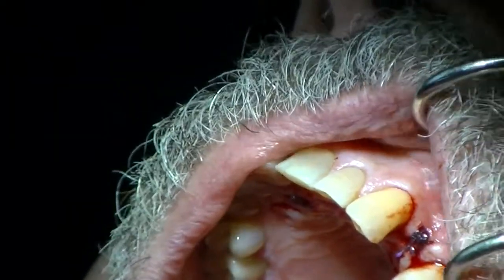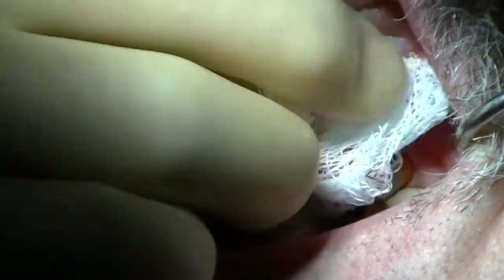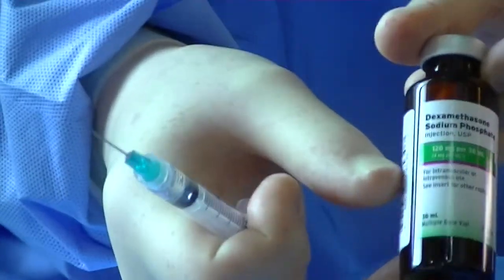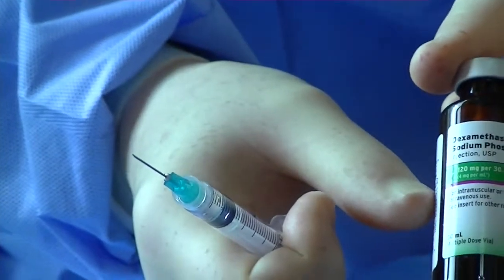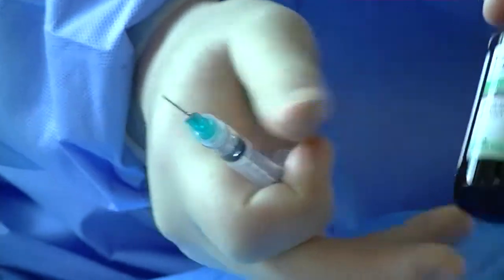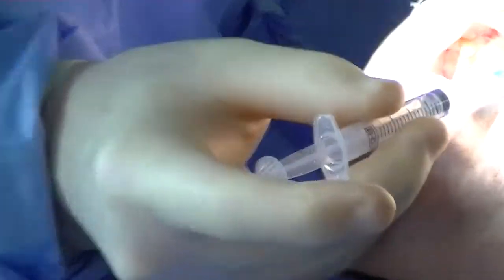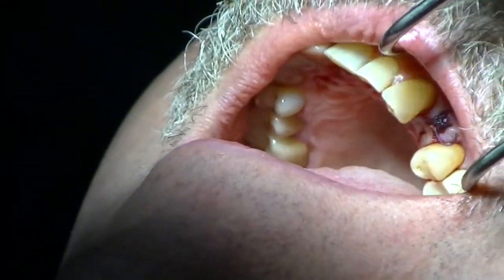And then whenever you finish the surgical procedure, I always give a good squeeze, remove any excess RBCs in that area. And as I mentioned, I like to give a little bit of a steroid post-operatively, dexamethasone sodium phosphate, 4 milligrams per ml. I'll give 1 cc in a syringe, and I'll just go into the vestibule, and this will help eliminate any swelling.